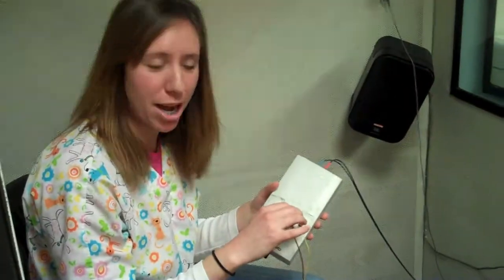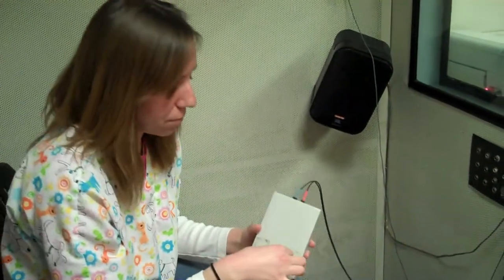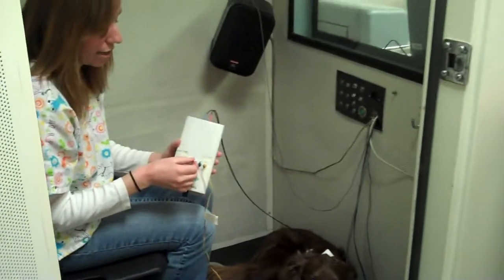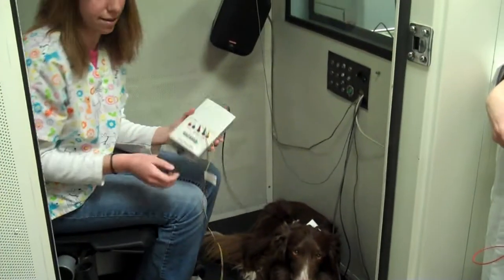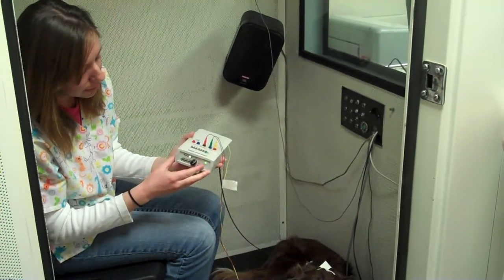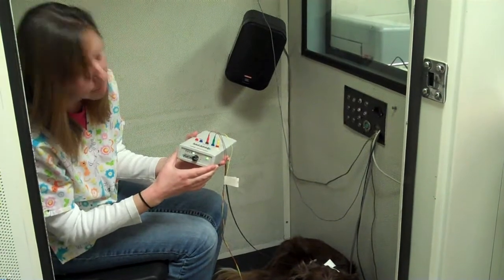We place the electrodes in the box here. The right ear goes into the negative because that's the test ear. Then we've got the positive side up here on her head, and the ground is the non-test ear. Then we checked our impedances — that one looks good, and the positive side looks good.